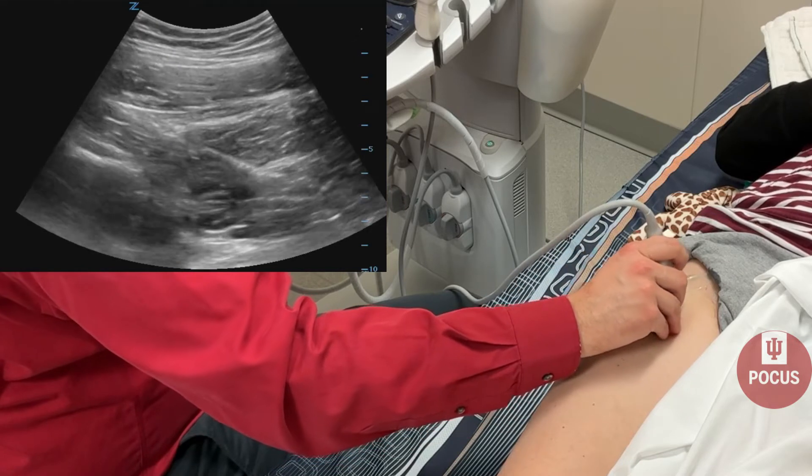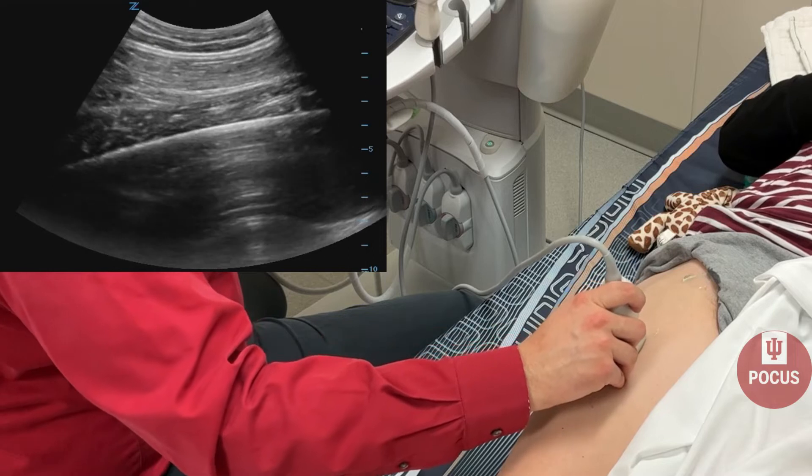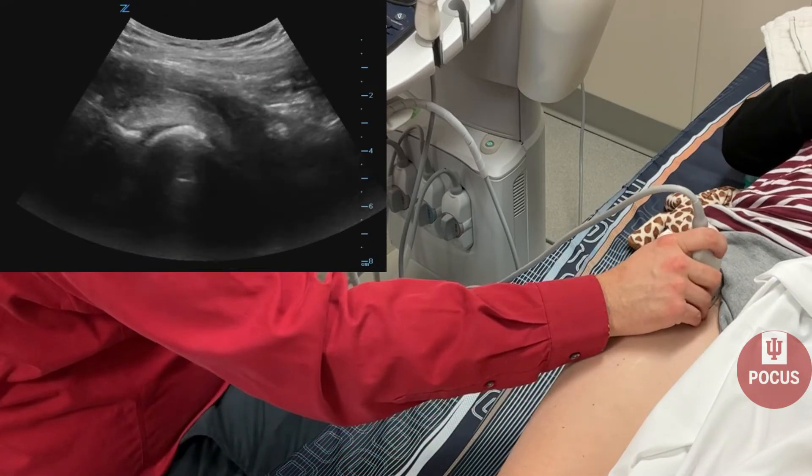Always make sure to turn the probe in two axes — longitudinal and short axis — when looking for fractures.